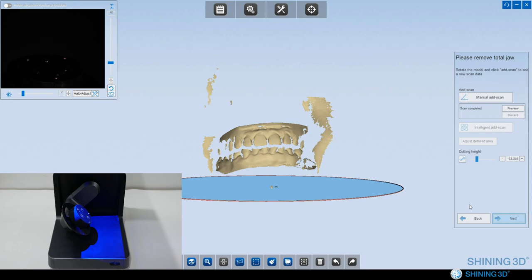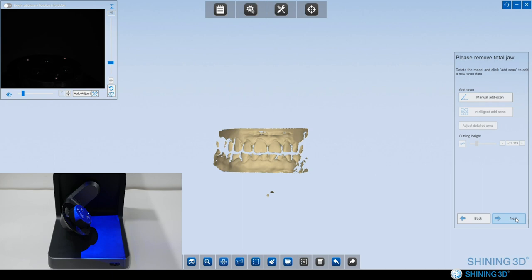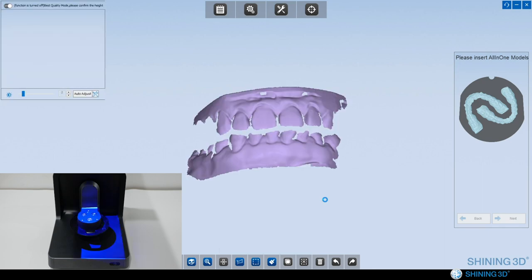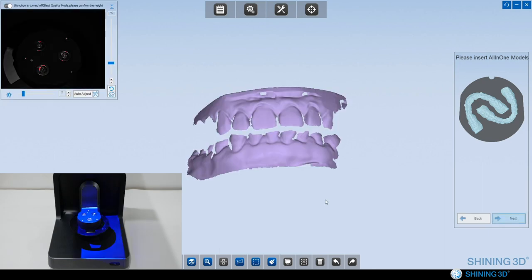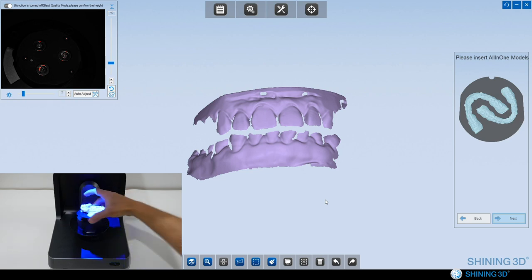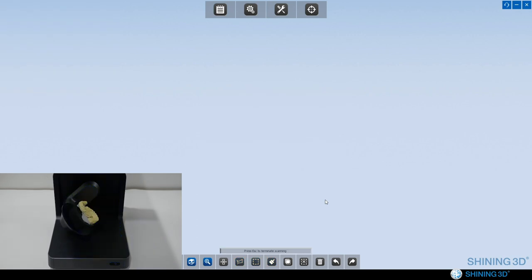So, say we need to edit the extra data. Click delete. Next. So in this step, we need to place upper jaw, lower jaw together onto the all-in-one plate. You can check the camera window below. Next.